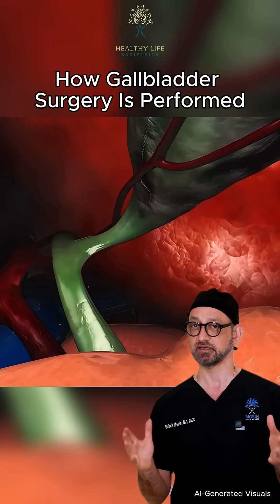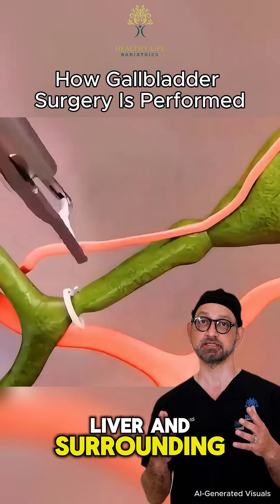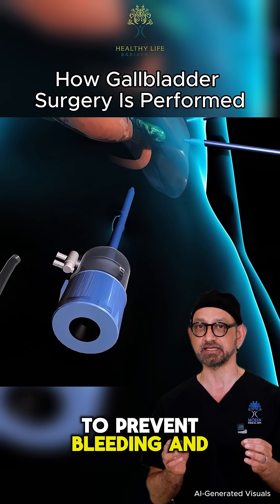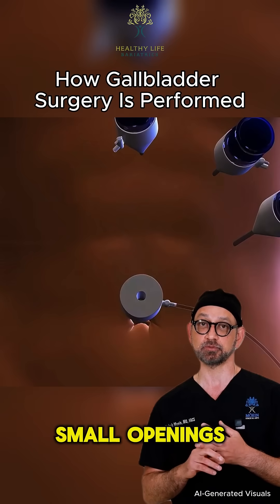As you can see, the gallbladder is gently separated from the liver and surrounding structures using long, thin instruments. We carefully identify and clip the cystic duct and cystic artery to prevent bleeding and bile leakage. Once fully detached, the gallbladder is removed through one of the small openings.